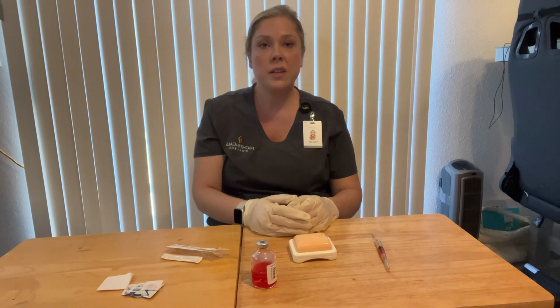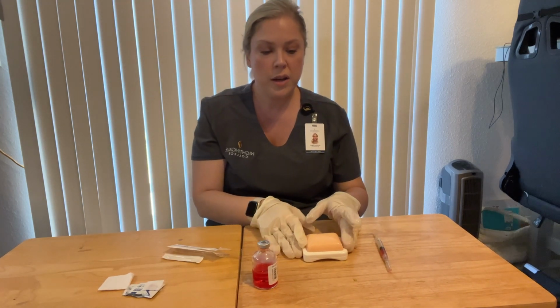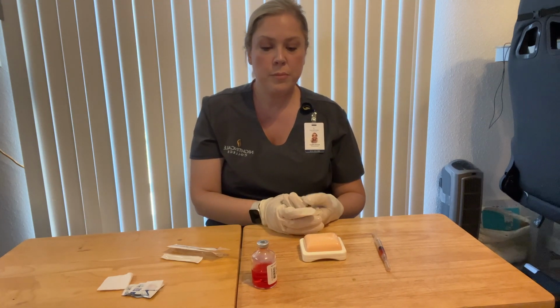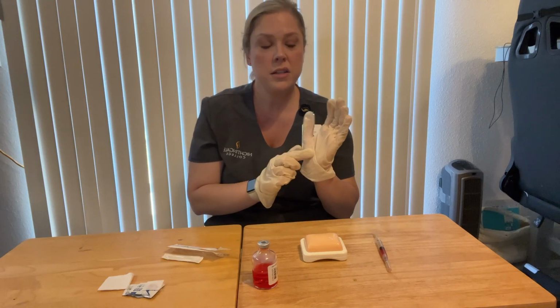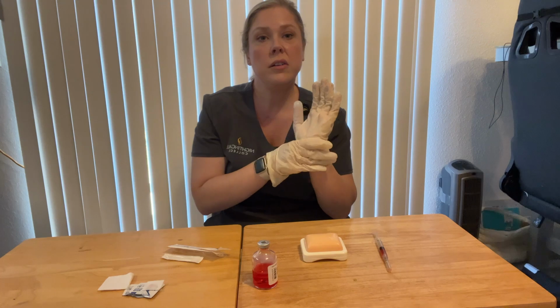So today we're using the ventral gluteal site. So we'd want to select our site for injection, which to do that we would need to use the heel of our hand here and place that along the greater trochanter area.